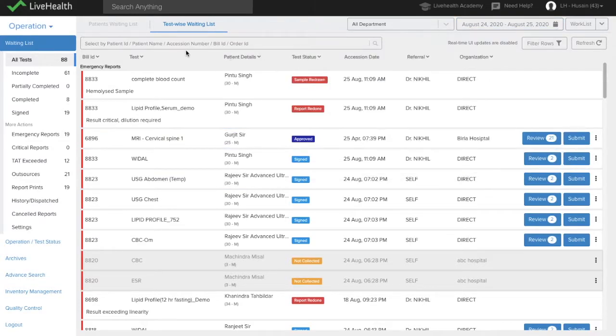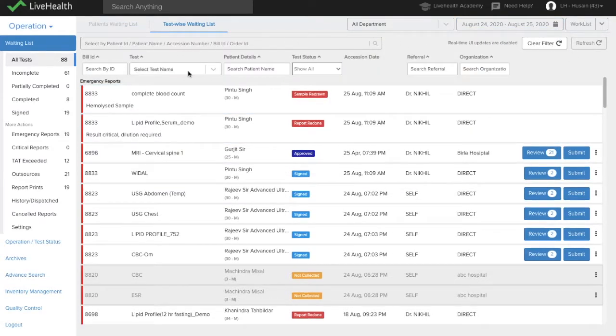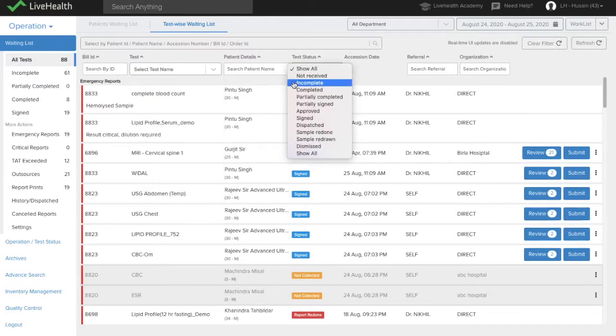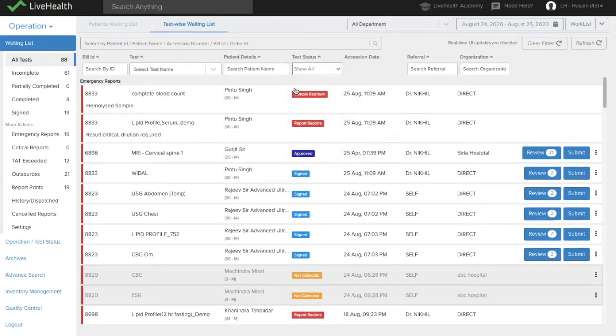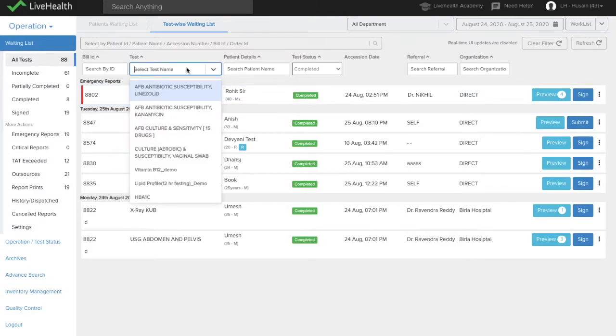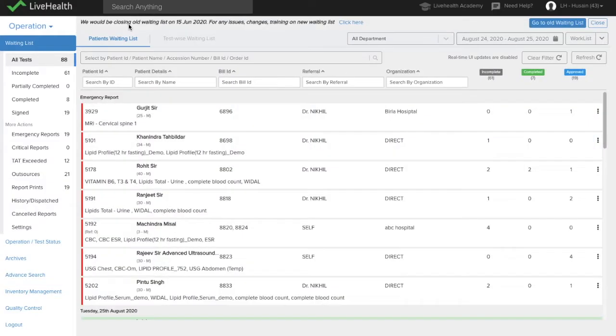Then you also have different filters available here. You can filter by test, by test status. So if you just want to see completed, you can just see completed reports. And if you're working in a particular test, then you can filter by that test. You can really filter down and focus on particular tests for a particular status.